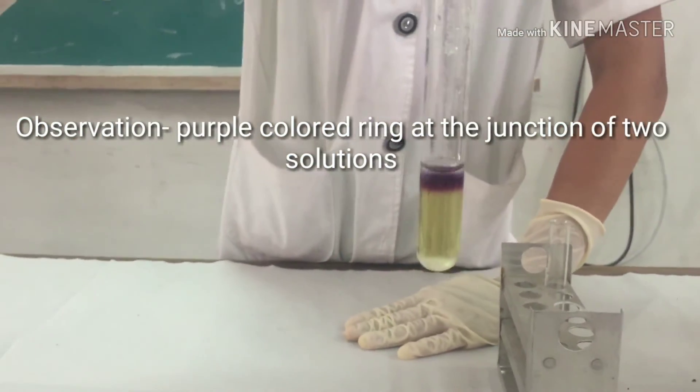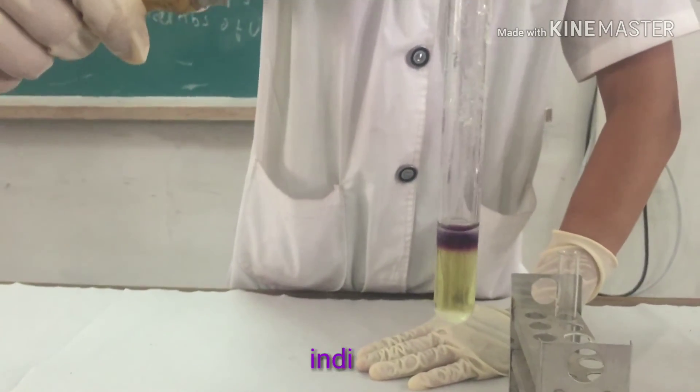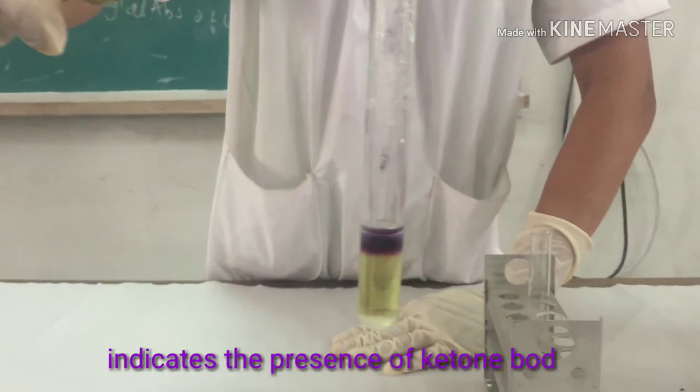We see there is a purple ring formation which indicates the positive Rothera's test.